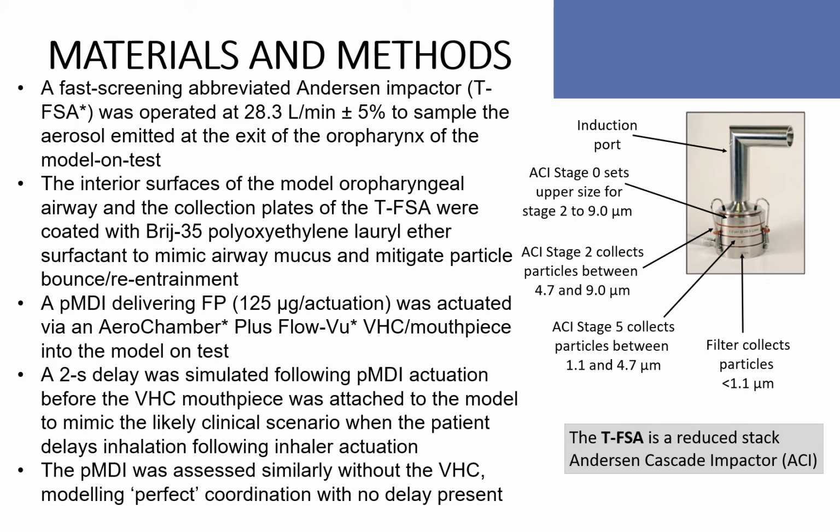and reentrainment. As a test aerosol, we used an MDI with fluticasone and actuated into the spacer on test with a 2-second delay to simulate what normally happens when a patient delays inhaling following inhaler actuation. The MDI was assessed similarly without the VHC, but in this case modeling perfect coordination with no delay present.